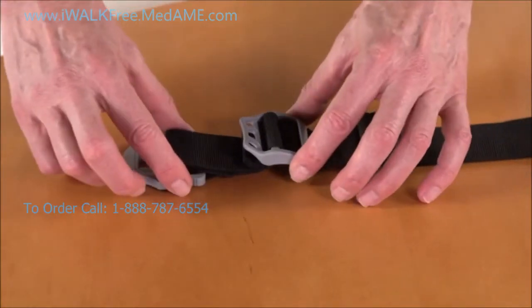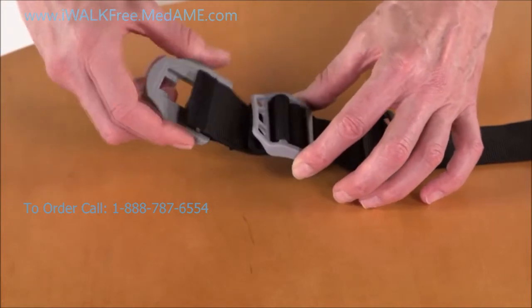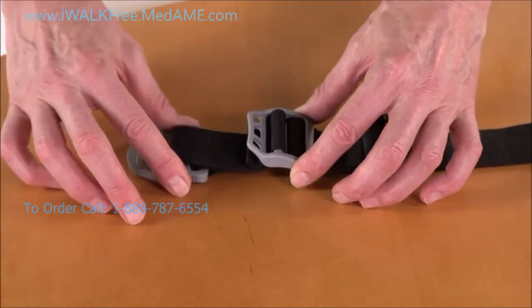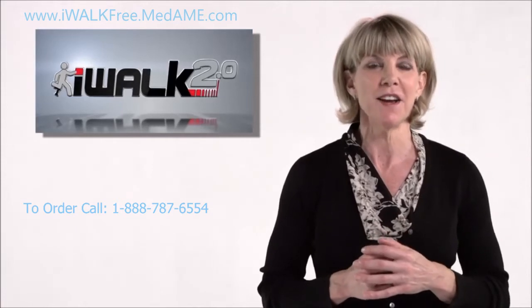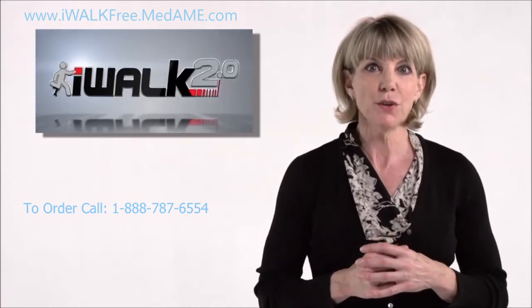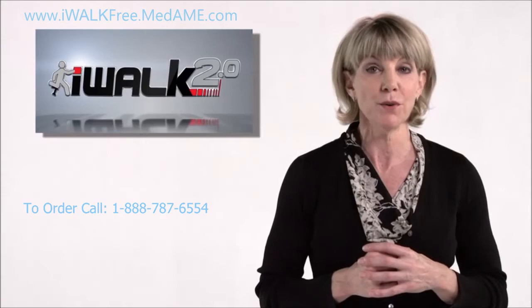The donning, doffing or on-off section, which has the grey buckles, is used to tension and release the strap so you can quickly and easily get into and out of the crutch. You'll use this each time you put on or take off your iWalk.